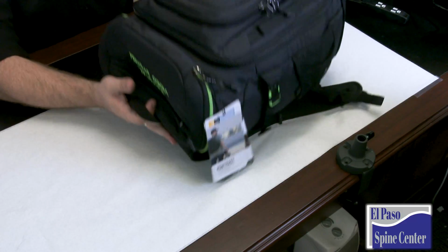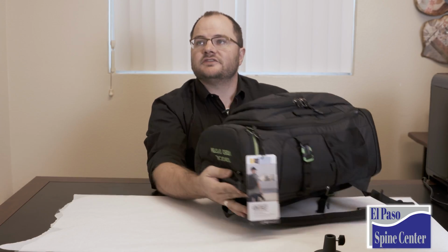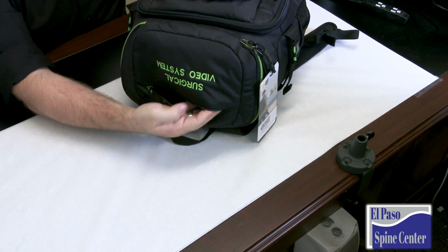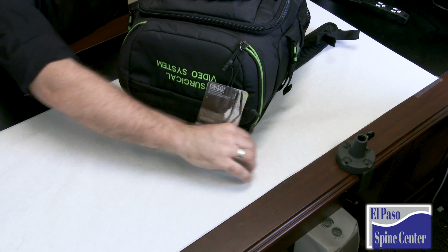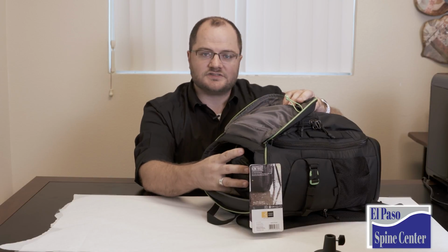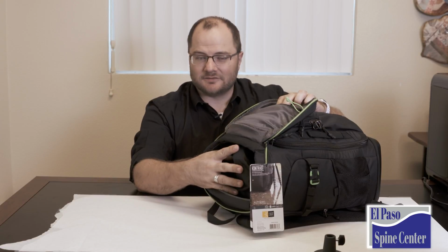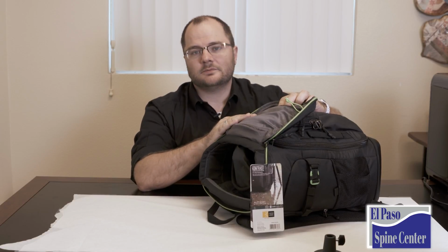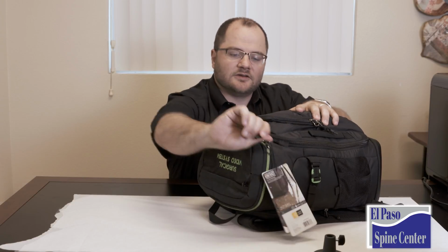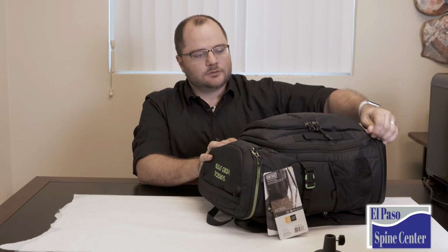Now, there are a couple of different openings here that we need to talk about. On the very top of the system, there's a zipper. All that does is it lets you into the main compartment. It's kind of too small to take anything out of. There's also a zipper here that opens up a larger opening. And right inside, you're going to see that there is a bag there. We're going to get to what that bag is in a second. I would actually leave this top part alone because the best way to get into the main compartment is actually through this largest outer zipper.